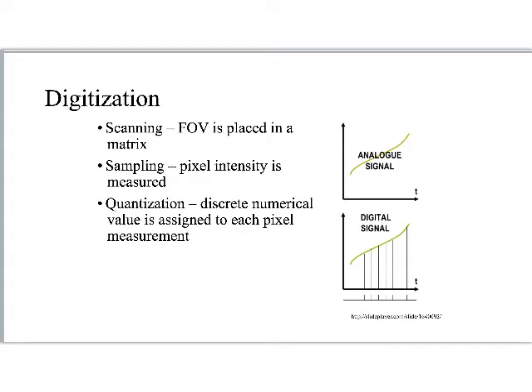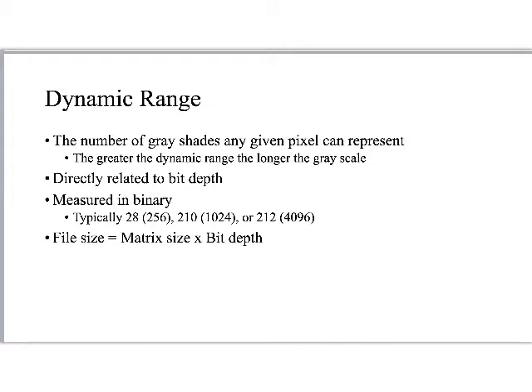So you can see, even as I'm talking about these things, they happen in very rapid sequence. We may not even think about these processes, but looking at these domains is going to be helpful to us to be able to think, okay, this is happening in the scanning part. This part's the actual sampling, and then this is how quantization occurs with both CR and DR systems.